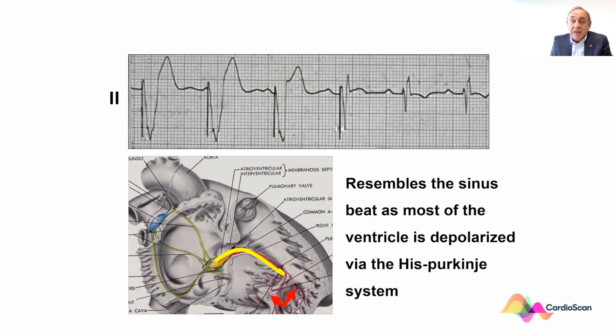Whereas the second one, as you can see here, is now depolarized virtually throughout through the sinus mechanism, and only a small area around the pacemaker lead is actually depolarized by the pacemaker. Remember that this is not pacemaker malfunction, but rather the impulse has not had time to traverse the myocardium into the area around the pacemaker and therefore inhibit the pacemaker output.